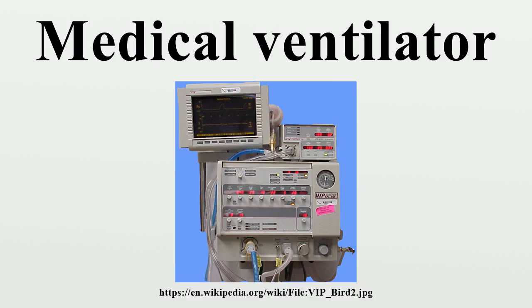Intensive care environments around the world were revolutionized in 1971 by the introduction of the first Servo 900 ventilator. It was a small, silent and effective electronic ventilator, with the famous servo feedback system controlling what had been set and regulating delivery. For the first time, the machine could deliver the set volume in volume control ventilation.